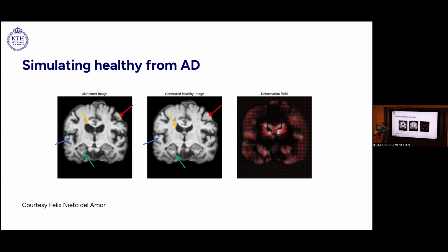He just used a normal GAN to generate a healthy image. So it's possible, but it's the same as I mentioned before. I was not super happy with, for example, these horns. This is not super anatomically correct. So I would like to test registration again for these purposes.